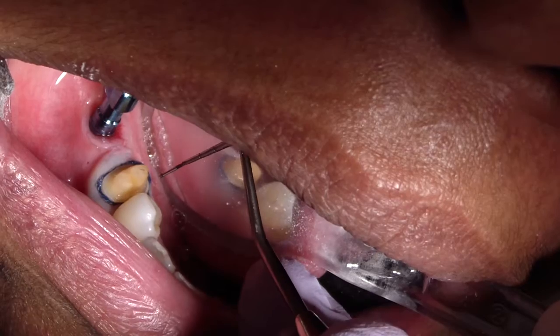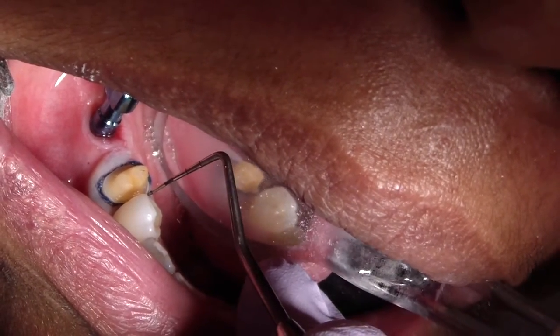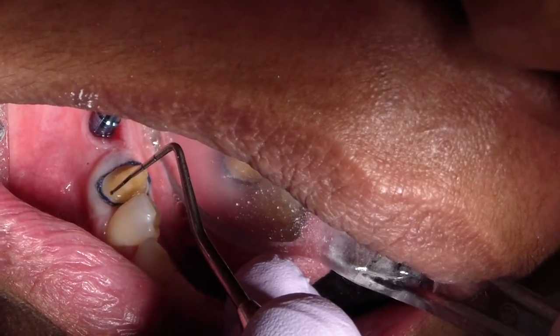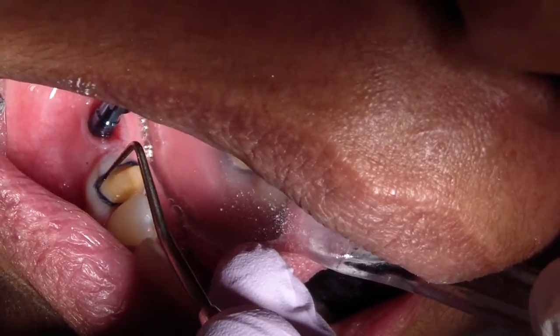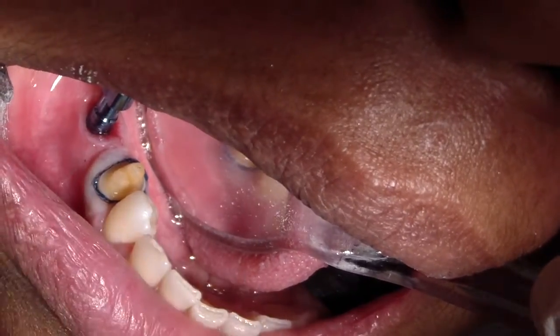So we're looking for a smooth margin, but also — especially for CAD/CAM or porcelain — making sure that there's no J, which means there's no sort of a lip on the margin that goes up like that. Making sure there's no margin that flares up. We're good in this situation. I've got a double cord technique packed and we're about to take an open tray impression. Cheers.